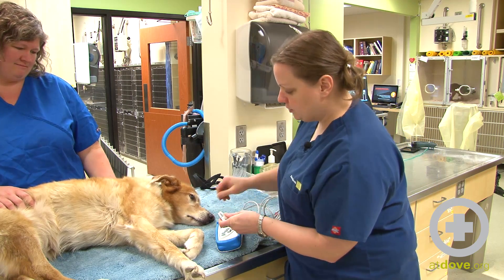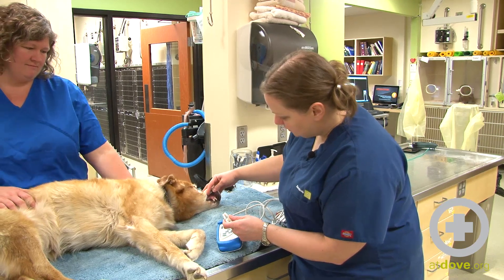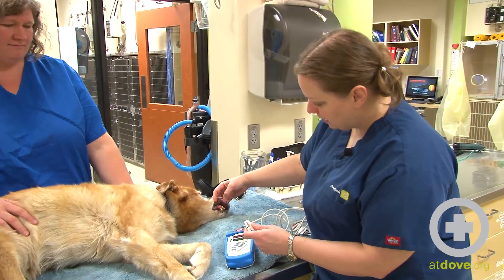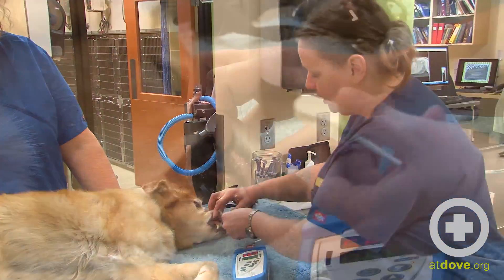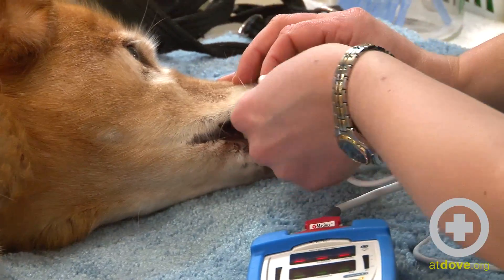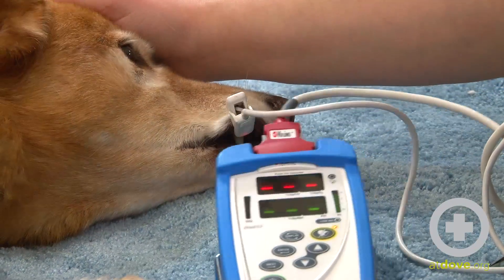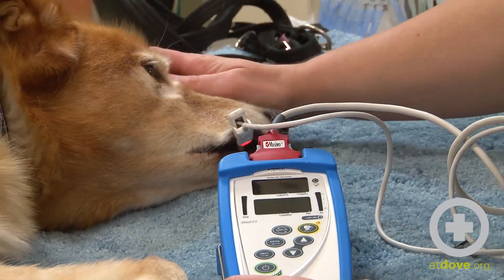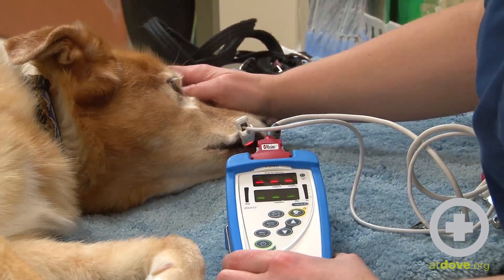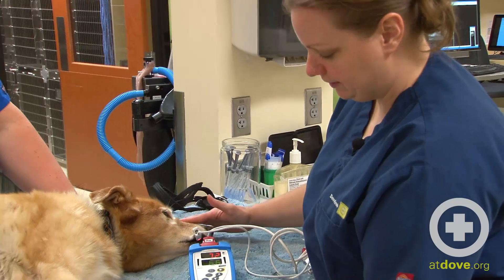On this dog I'm going to try her lip. You can see she does have some pigment on her lip, but she's got a good pink spot right there. I'm going to take the probe and place it on her lip — she's been a very good girl. A lot of dogs try to swallow or chew the probe out, so anything you can do to distract them to keep that on there.